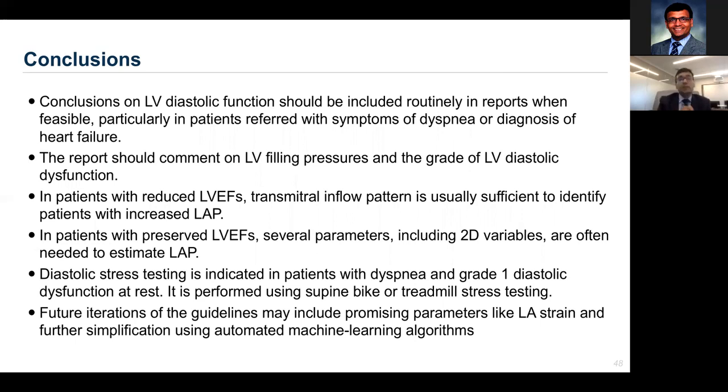So thus to conclude, LV diastolic dysfunction is a latent behavior of the myocardium that cannot be measured directly with a single parameter and requires multiple parameters to be assessed. It should be assessed routinely and presented routinely in clinical reports. Particularly, it's relevant for management of patients who come in with symptoms of dyspnea.